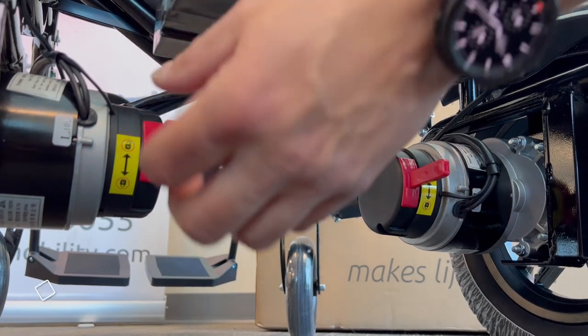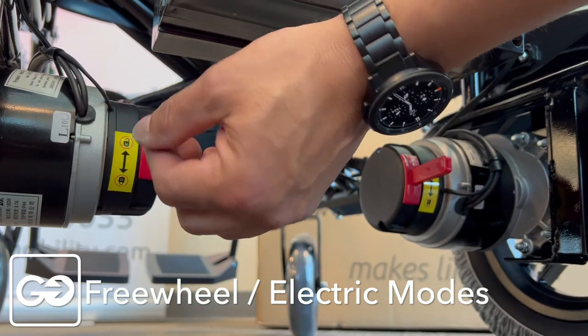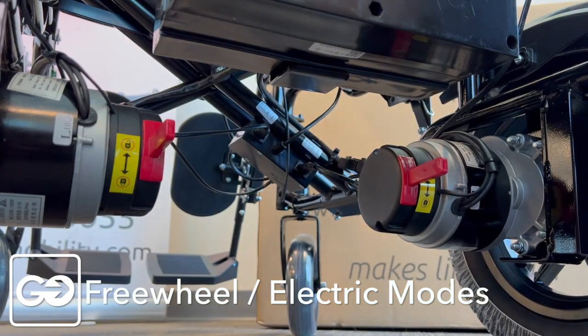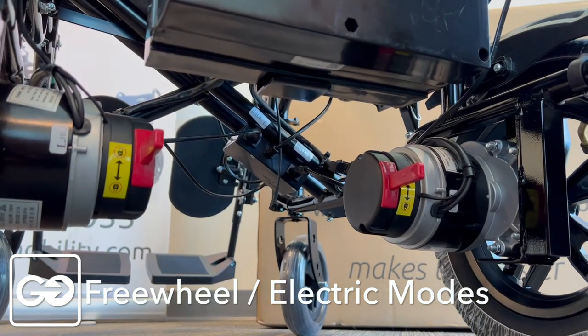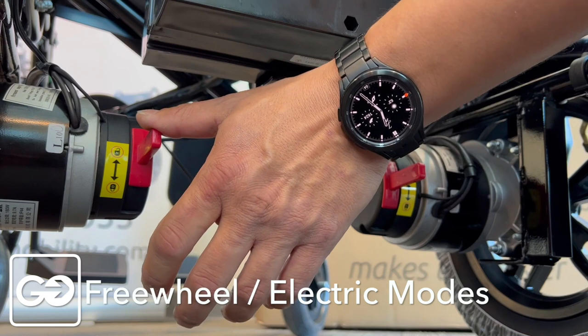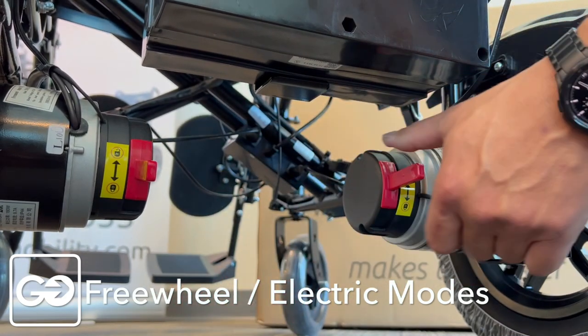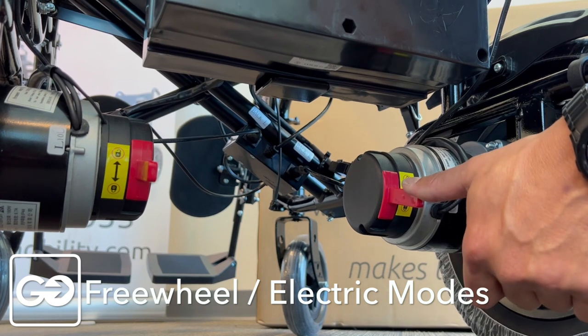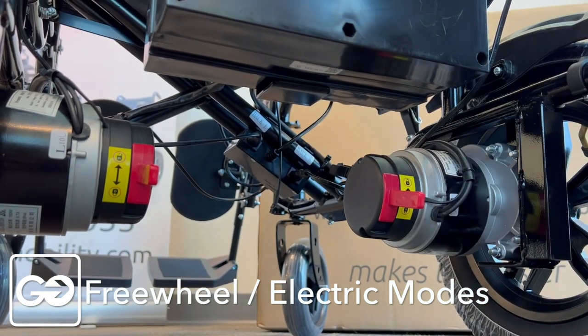When you receive your chair, you're going to notice that the locking system here is on the unlock position. Unlock allows free wheels — we can take the chair in the unlock position and push it back and forth. To activate your chair and get it working with the system and the controller, you want to make sure these are in the full lock position on the left side and right side. You hear that clicking sound — that means our wheels are engaged, our motors are engaged, and now the power system works on our chair.